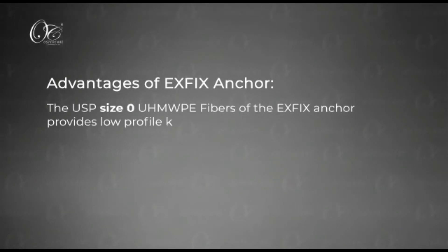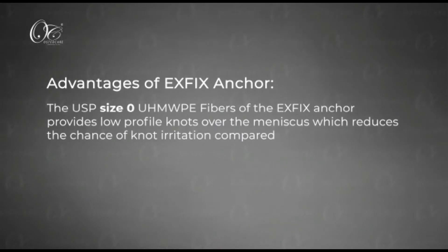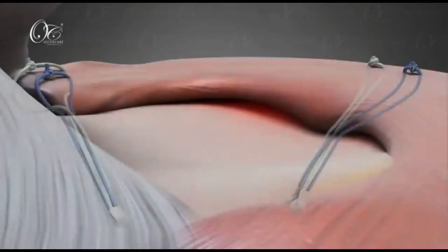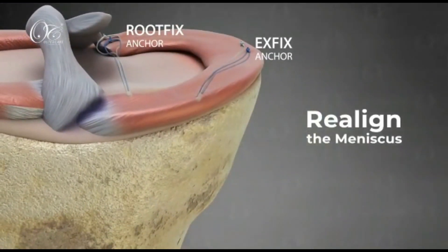This has many advantages. It is a low profile knot over the meniscus which reduces the chances of knot irritation. The smaller diameter of the ex-fix anchor provides excellent pullout strength and it can be used in combination with a root fix anchor for a very nice result.